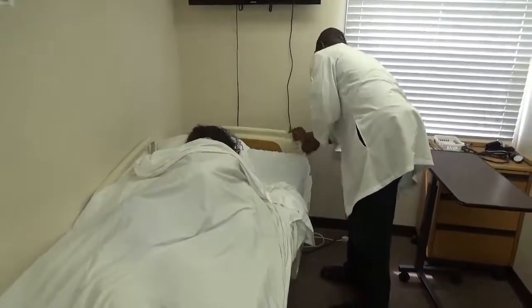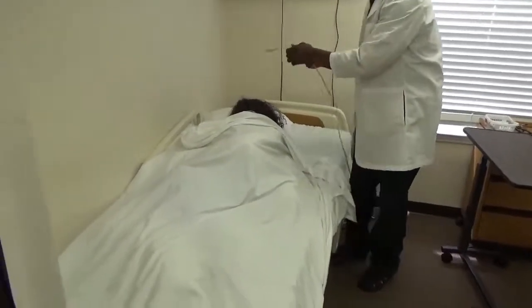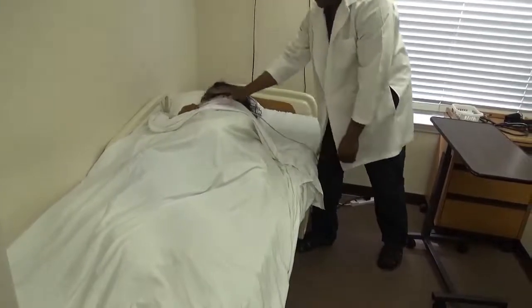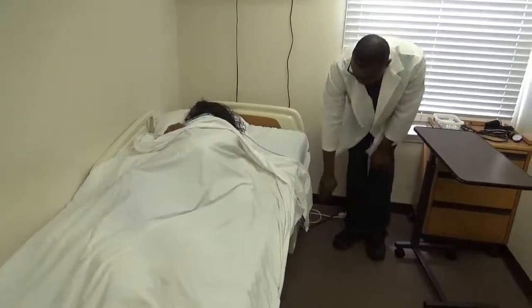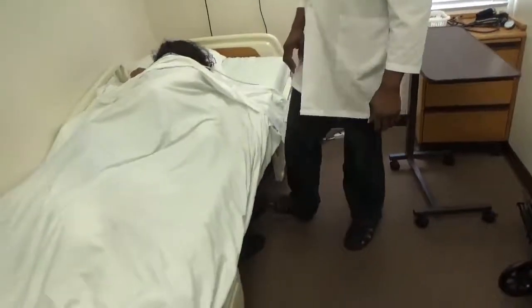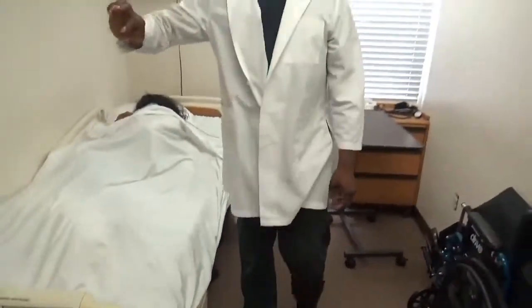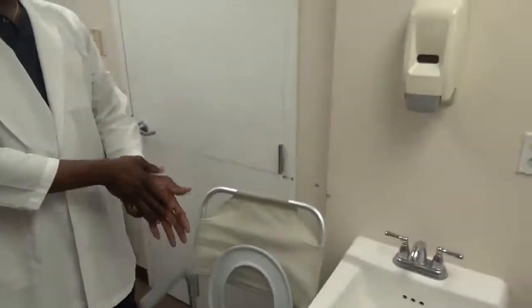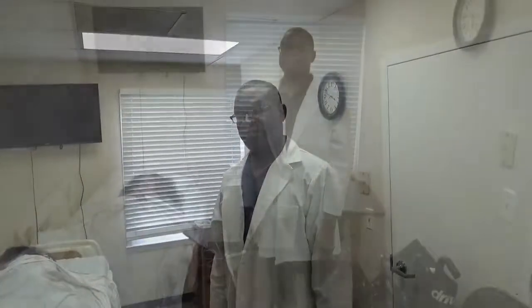Okay, we're finished. Give her her call light. Make sure she's holding on to it. Here's your call light, in case you need help. The bed is in the lowest position. The bed is locked. Undo privacy. Now wash my hands, and that concludes placing the resident on the side.